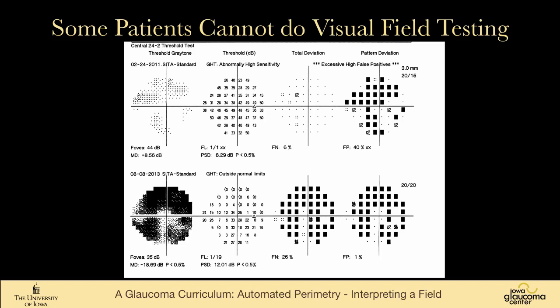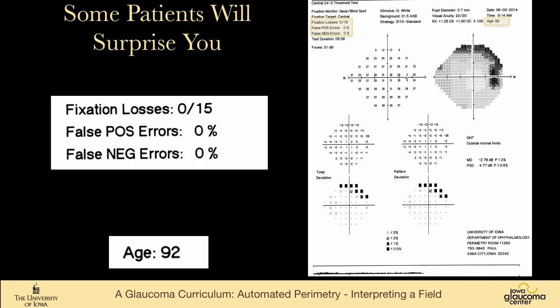Just a few closing comments. First, some people can't do visual fields. This is a patient who has enormous false positivity. This whole thing is white. And again, the disconnect here. On repeat, instead of false positivity, the patient had lots and lots of false negativity. So some people can't do automated field testing or field testing at all. On the other hand, some patients will surprise you. You might not think that you can get a visual field on a 92-year-old patient. But this person's performance was spectacular.